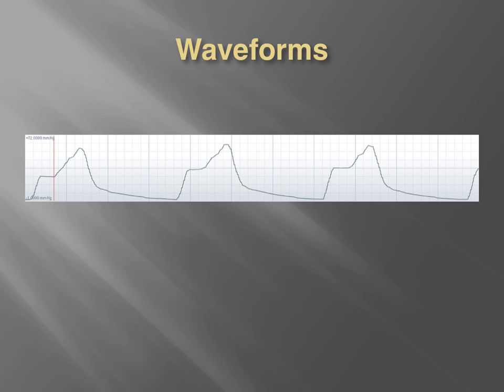So what we have here, this was a COPD exacerbation and cardiac arrest. In cardiac arrest before we got there, and we began doing our CPR and ventilating, and in this process of hooking up the end-tidal capnography with the bag valve mask and subsequently with intubation as well, we get back pulses relatively quickly after intubation, and over the course of time we start getting this waveform.